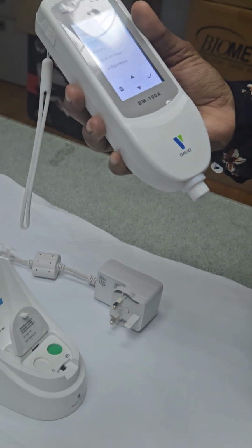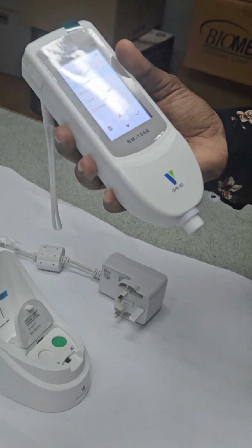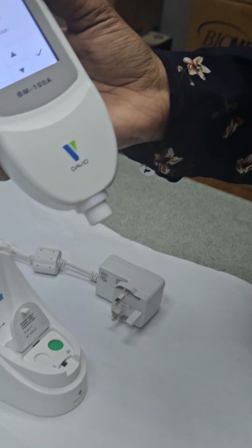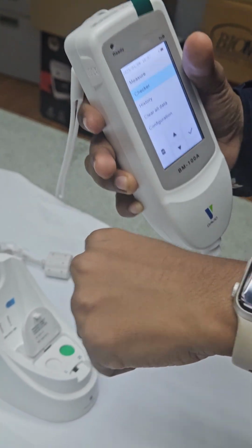Okay. So the blood one is still more accurate than this. The blood one is still more accurate because it's an internal part. This is on our skin. Okay.